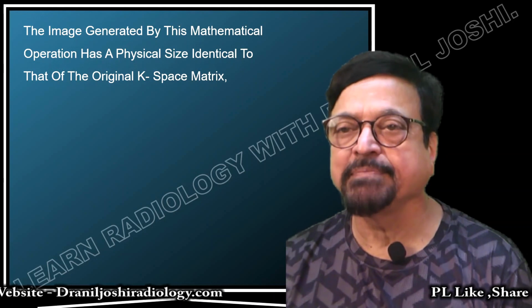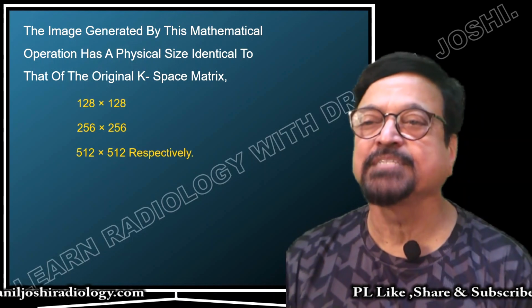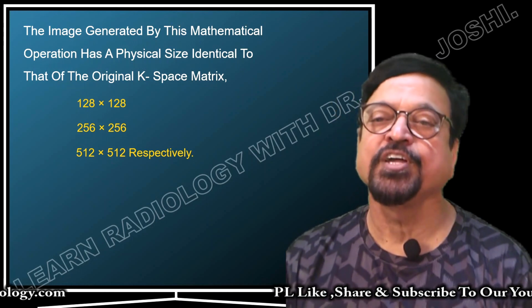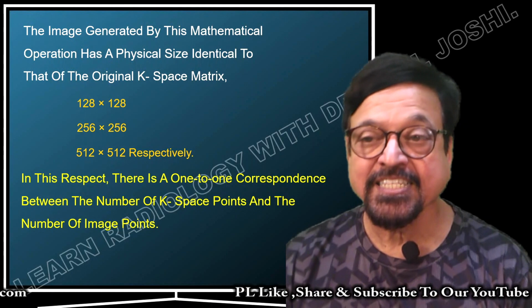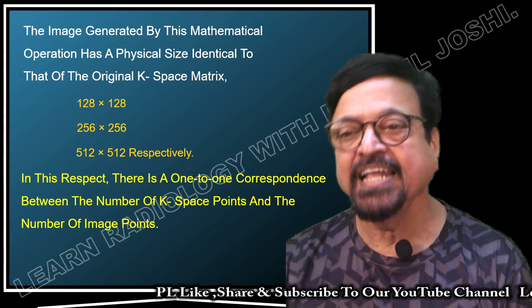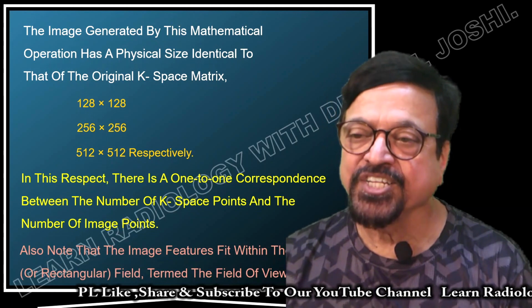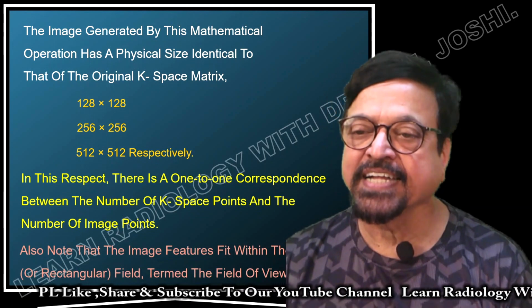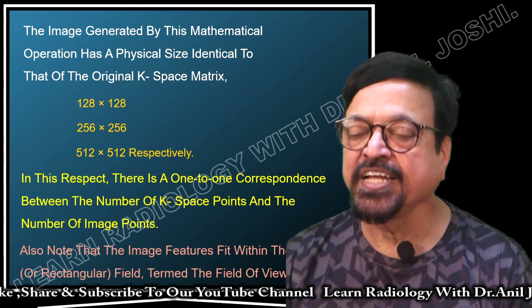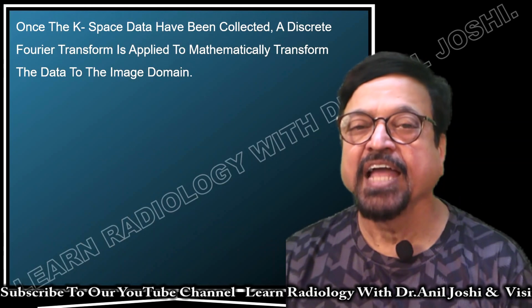The image generated by the mathematical operation has a physical size identical to that of the original k-space matrix, like 128 by 128, 256 by 256, and 512 by 512. In this respect, there is a one-to-one correspondence between the number of k-space points and the number of image points. Also note that the image features fit within the square or rectangular field termed the field of view, FOV, as we usually shorten it.